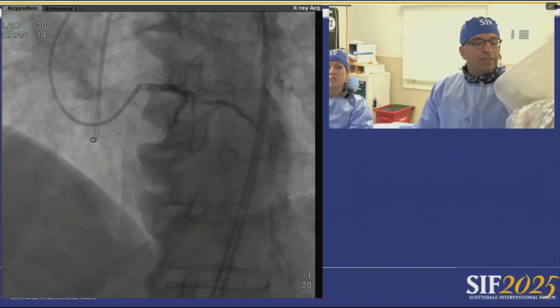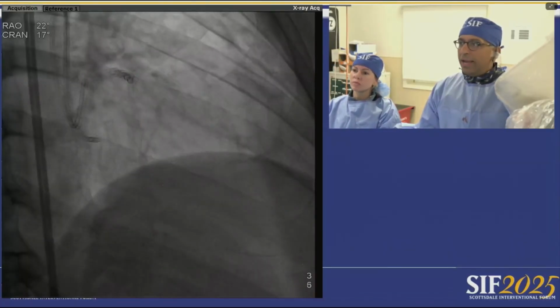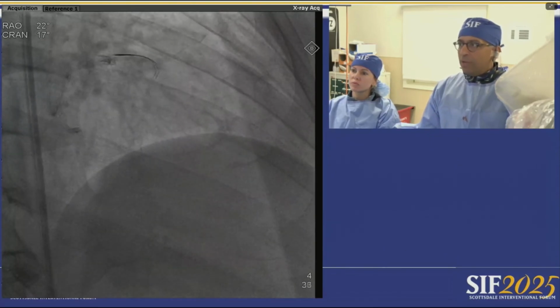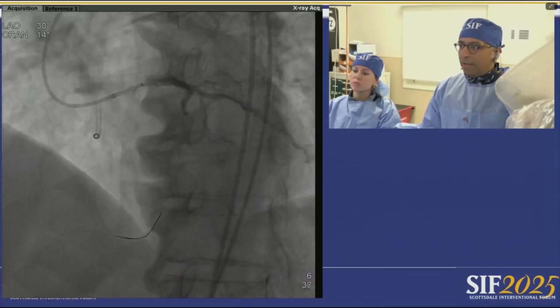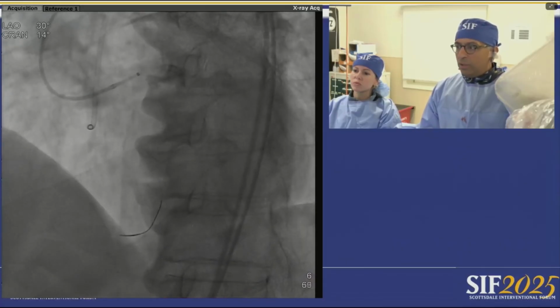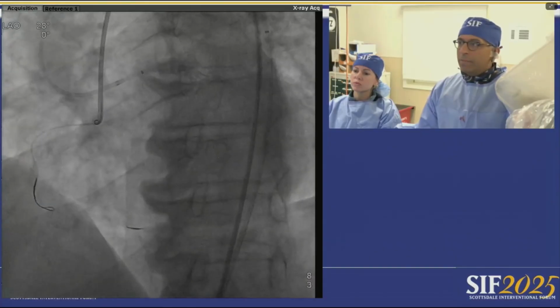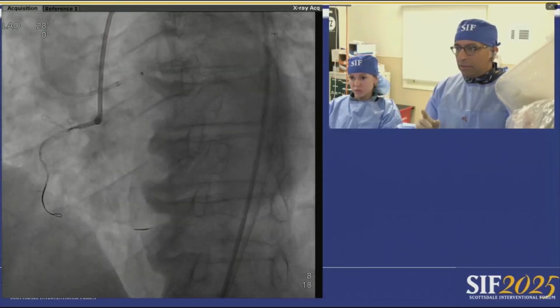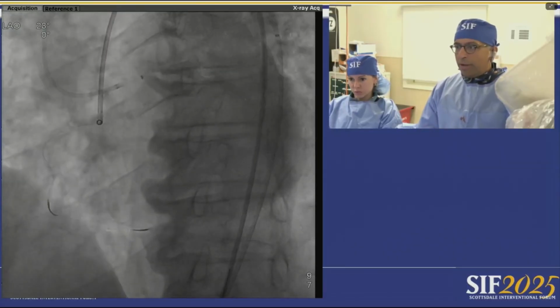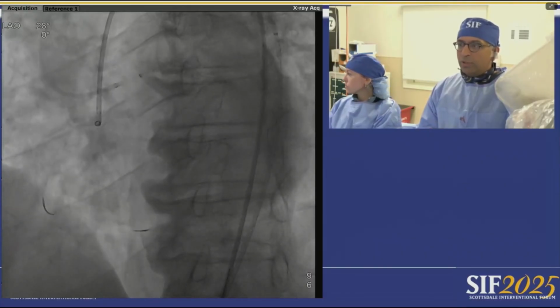As for the next thing I did, I was able to retro wire the septal, and right now I have a microcatheter in the PDA, as you can see. And this is the RotaWire, then an antegrade microcatheter that's in the distal right, but proximal to this proximal cap.